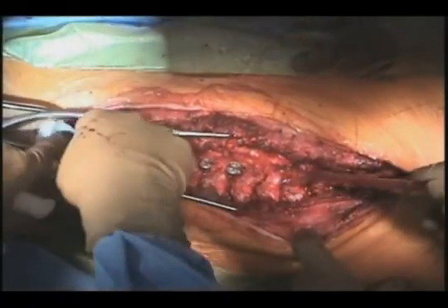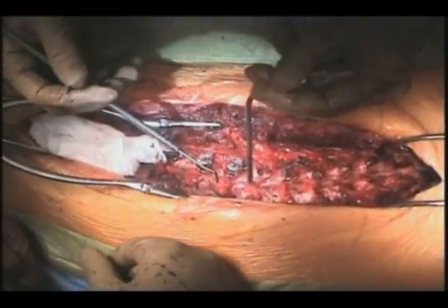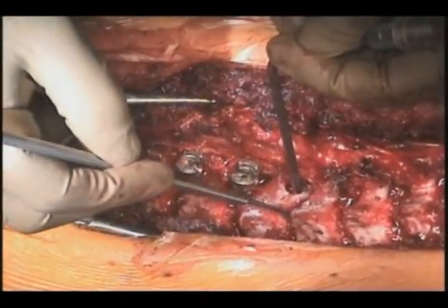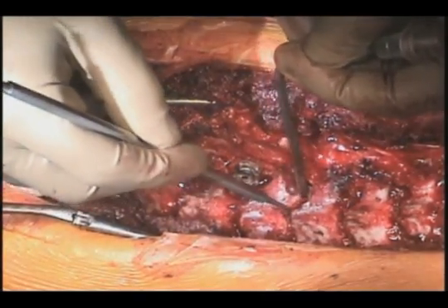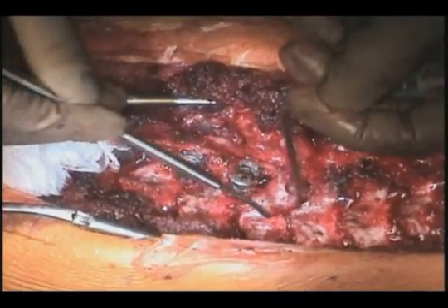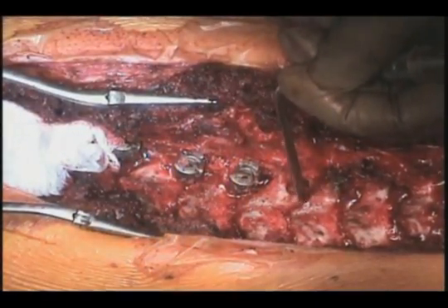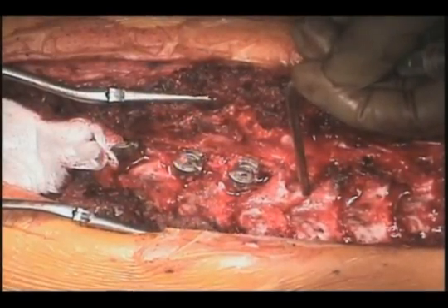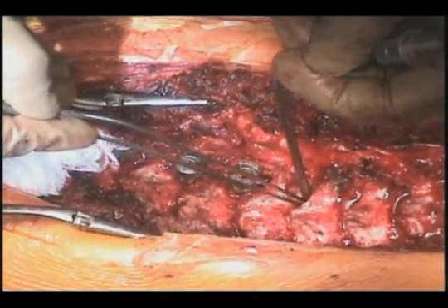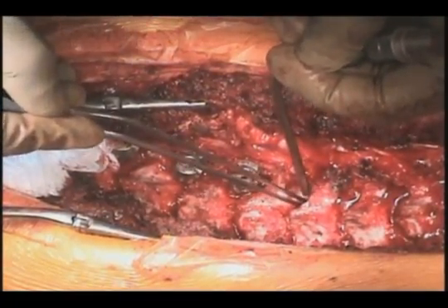We'll continue with placement of the screws on the concave side of the spine. And here I'm using a dental probe, or a Woodson probe. Since I have an interspinous opening by resection of the ligamentum flavum, I can easily palpate the pedicle, and that really allows me to define the cephalad, caudad, and medial aspects of the pedicle, guiding my probing of the pedicle. You can use a bipolar cautery to control any local bleeding of epidural venous structures.